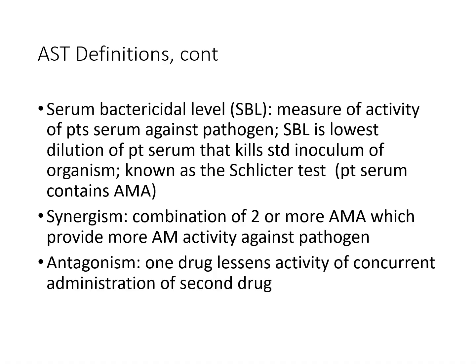For serum bactericidal levels, by definition, it's the measure of the activity of a patient's serum against a pathogen. The lowest dilution of a patient's serum that kills a standard inoculum of the organism, also known as the Schlichter test. The patient's serum contains antimicrobial agents.